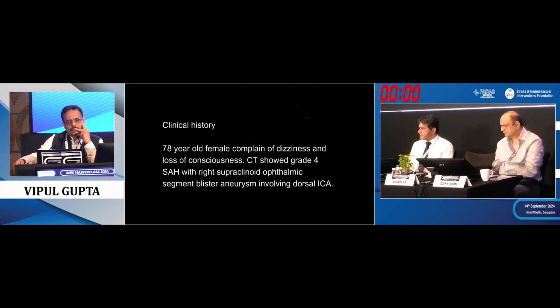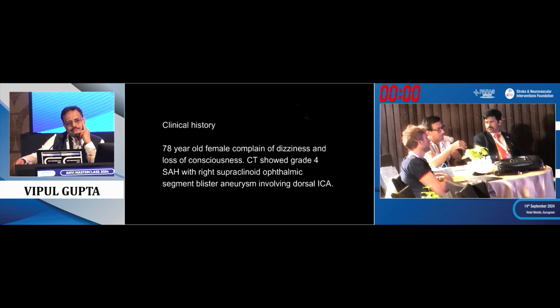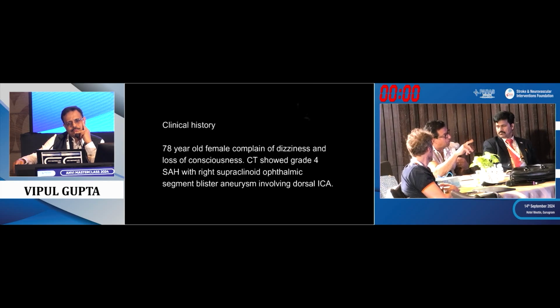So a single flow diverter is not necessarily absolute protection. You may be protected, but you still have a risk. So where cost is not an issue, I just put 2 flow diverters. If it's a blister without a coil, I put 2. If I get a coil, then I'm much more comfortable putting 1 flow diverter.